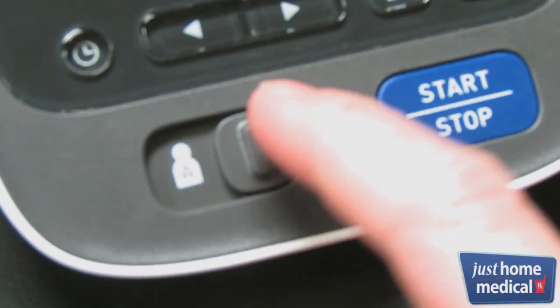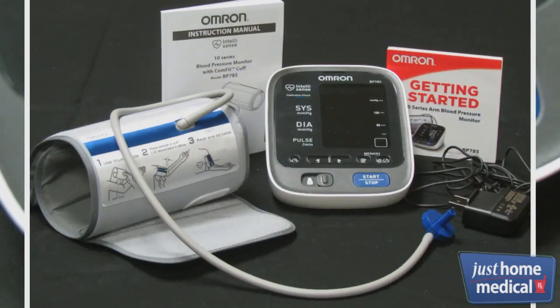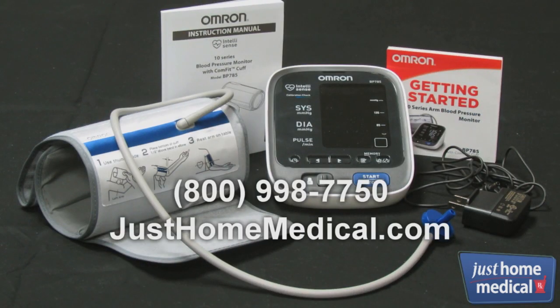It has the ability to store information for up to two users. To learn more or place an order, visit our website.